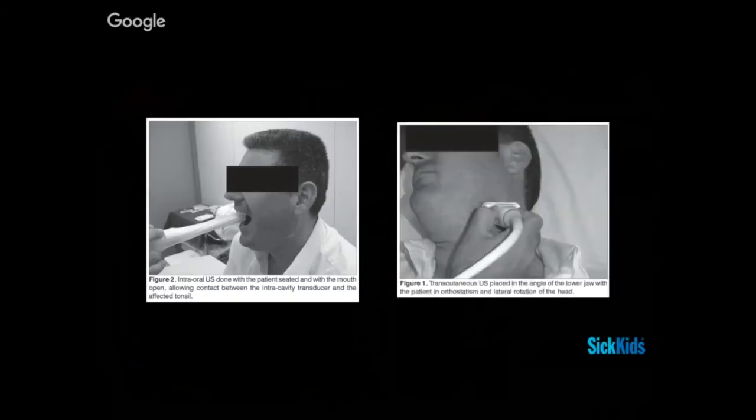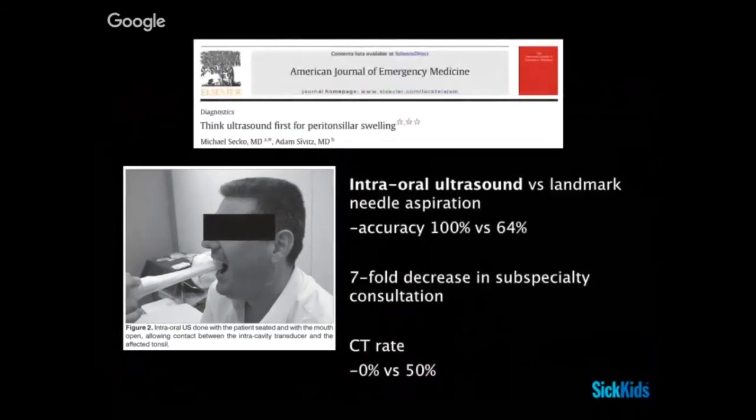The other way that you can look for peritonsillar abscess is the transcutaneous or transcervical technique that we'll talk about as well. This technique is great because if you have trismus, it allows you to see without needing to open the mouth. It also means that you're not needing to undergo that infection control protocol, and it's often well tolerated by patients. So there's a few studies that look at this, but this is a nice summary paper that I encourage you to read if you want to get more information.